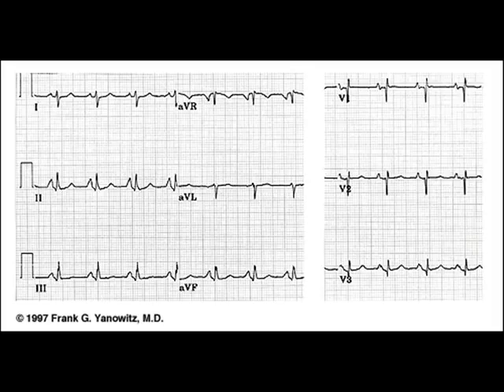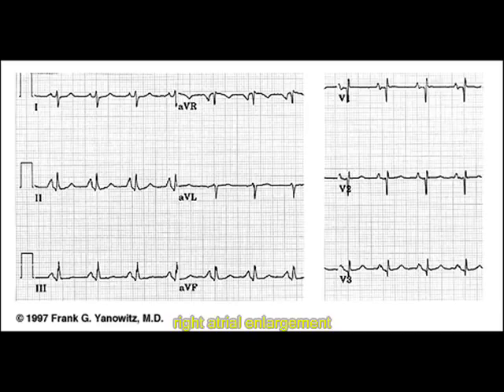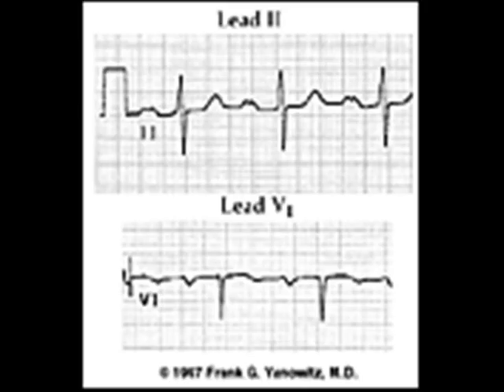Here you can see a big P wave. This is very common in right atrial enlargement, because when the atria is big the P wave will be big. Now you can also see left atrial enlargement. In left atrial enlargement you can see a notched P wave or M-shaped P wave, especially in the upper EKG. This is characteristic of left atrial enlargement.